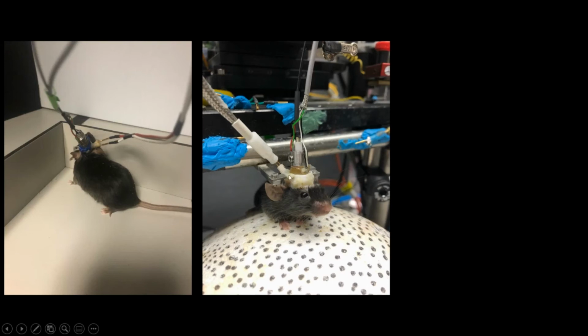You screw the animal's head bracket in here. And in this image, I was just floating a styrofoam ball underneath the animal. That basically means you have the styrofoam ball, you're shooting air underneath it, and it's creating this sort of rolling surface for the animal. And you can still track motion by looking at the ball and how dots that are visually represented move.